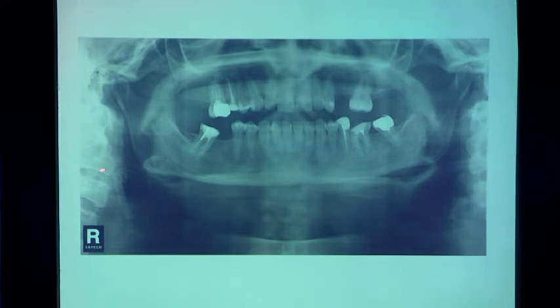If you look at it on the left side and the right side, okay, this is the right side, this is the left side, what do you see? See something, some big bony thing here? You see or no? Is it clear or no? Bilateral. There's an artificial joint which is created here.